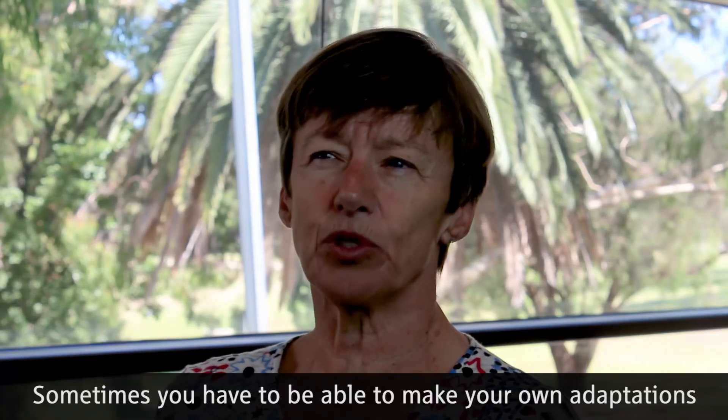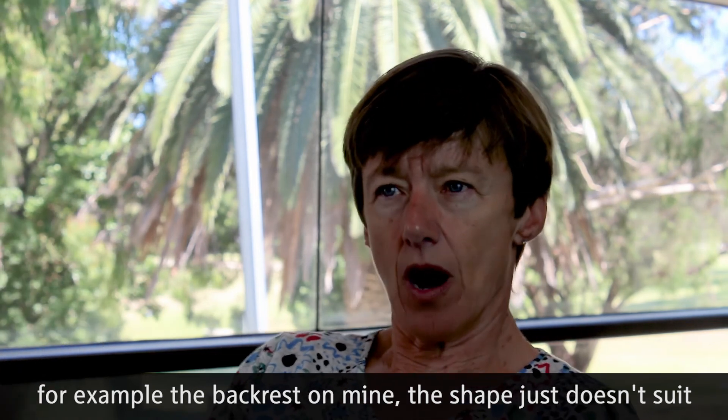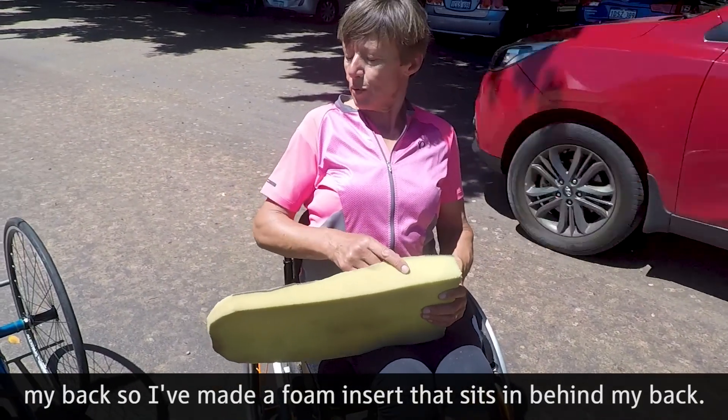Sometimes you have to make your own adaptations. For example, the backrest in mine — the shape just doesn't suit my back, so I've made a foam insert that sits behind my back.